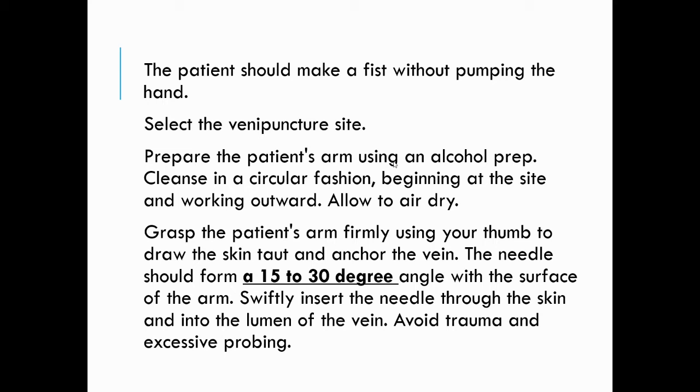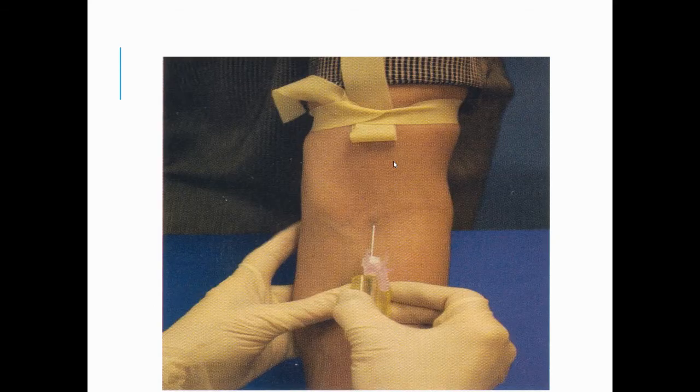The needle should form a 15 to 30-degree angle with the surface of the arm, and insert the needle through the skin and into the lumen of the vein and avoid trauma and excessive probing. So, puhon-puhon you will be able to perform this, but not yet, not for now, because there will be registered medical technologists who will be supervising your procedure. So, just take note of the things that you should be aware of.